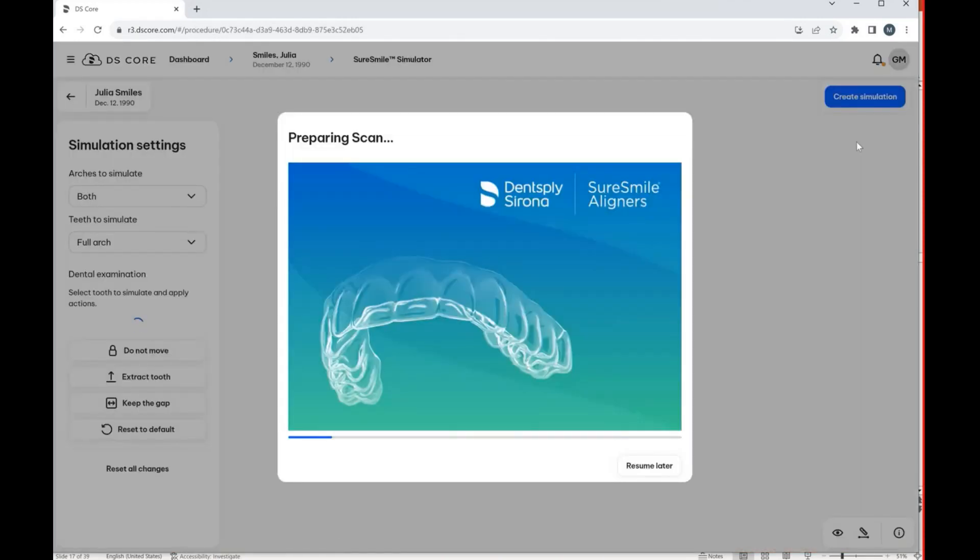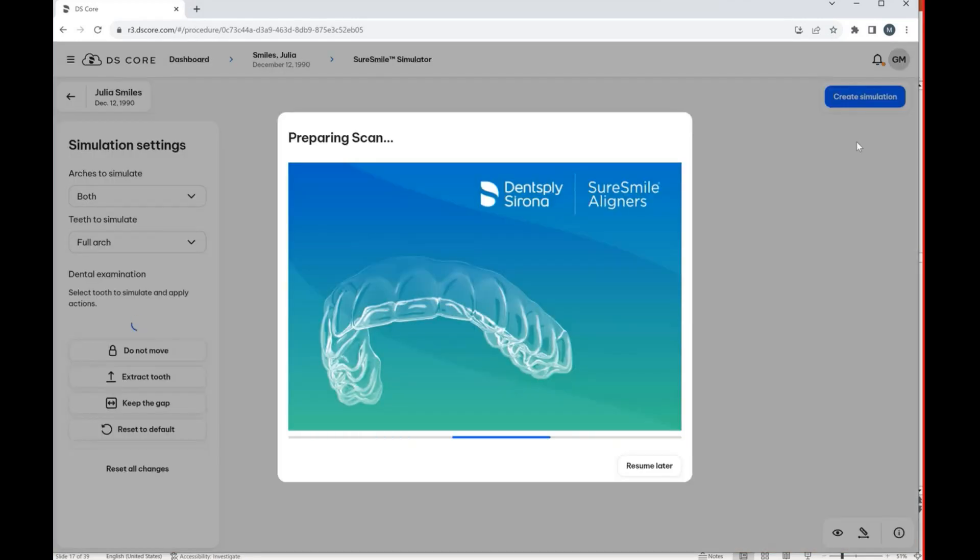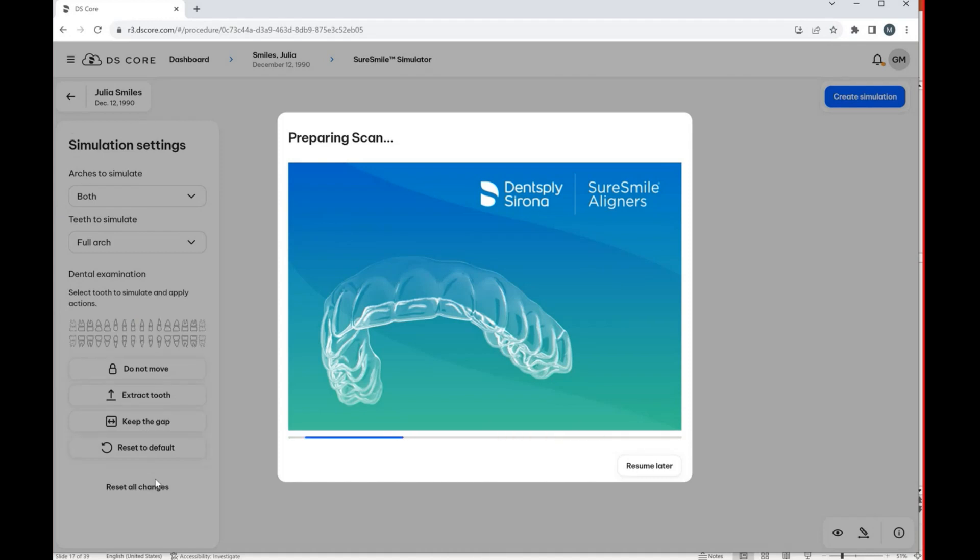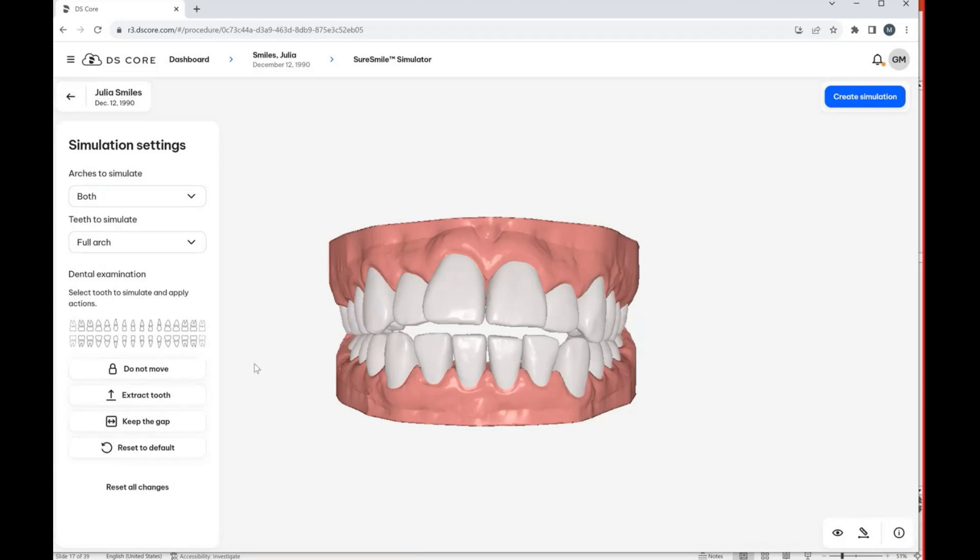If you select SureSmile Simulator, it will open up this screen that you see here in front of you, and it's basically preparing the scan. Now one thing that you are going to notice is that on the left-hand side, there's a couple simulation settings that we are able to change as soon as this screen here for preparing the scan is finished.